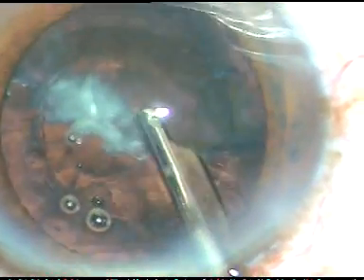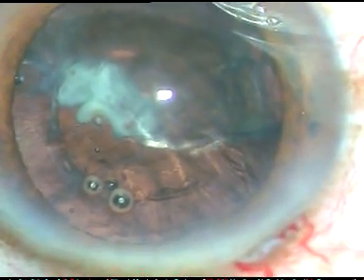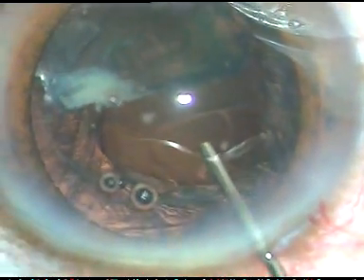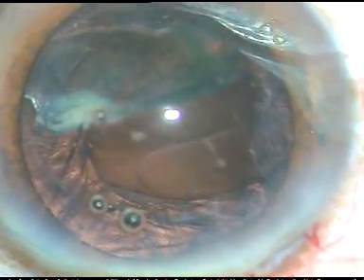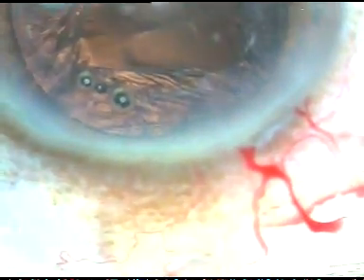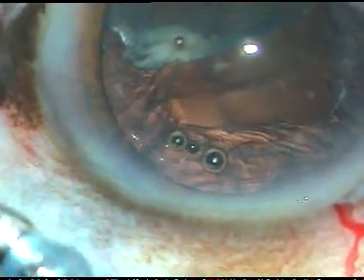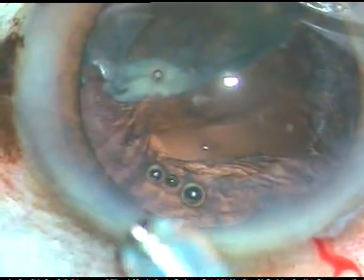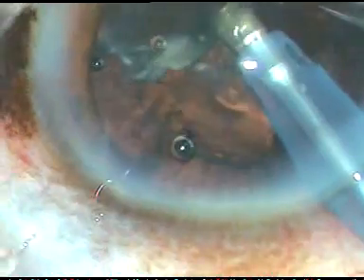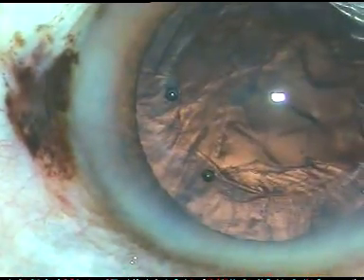Yes, the epinucleus is now free. So I inject some more Viscoat underneath this epinuclear plate and seal the rent again. The Viscoat has a nice ability to plug the PC rent. This is a quite large rent, but it is being nicely plugged by Viscoat. One more reason — maybe I am lucky to have solid vitreous in this case. Here it is. The epinuclear plate came out. And the Viscoat is still plugging the posterior capsule.